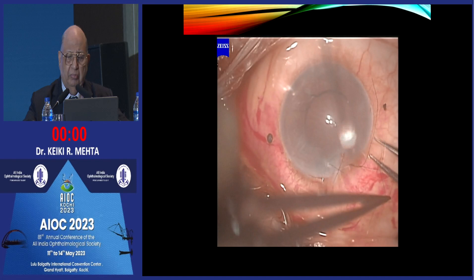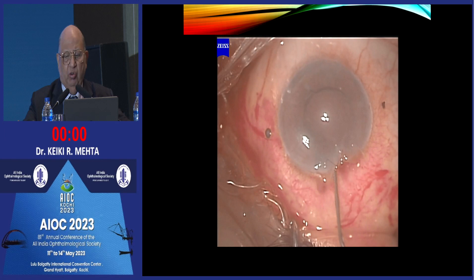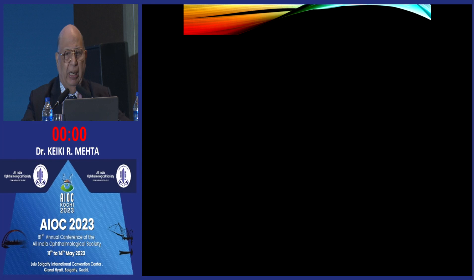As you notice, the lens is totally stable once it is placed with the bung below it — it literally stabilizes the lens. The quality of the lens subsequently is far better. Then all you have to do is open up the conjunctiva to the side, cover up your proline parts, and that is it. These are simple methods which I hope you enjoy and can utilize in your own practice. Thank you.